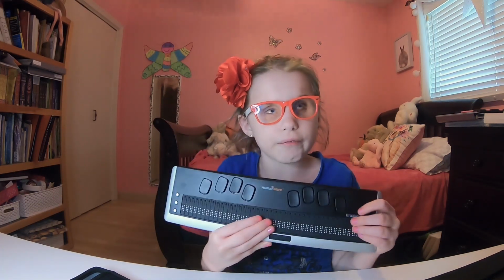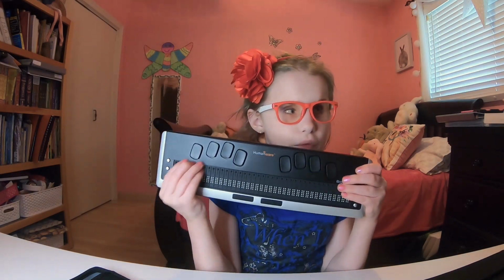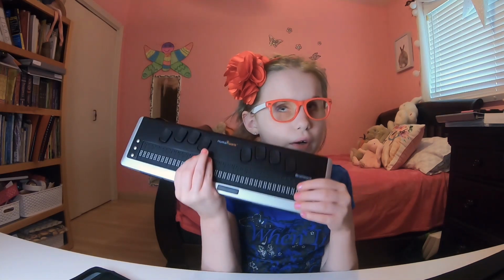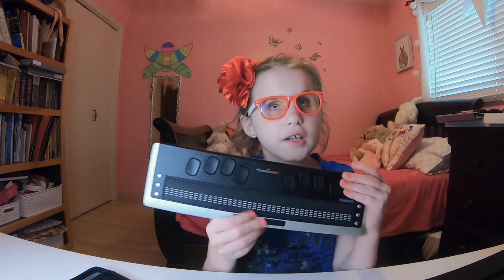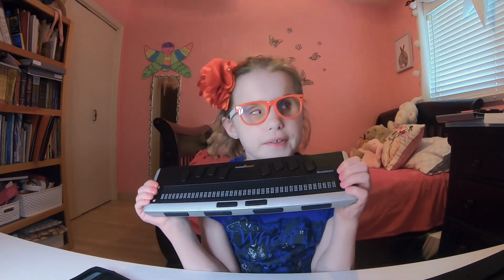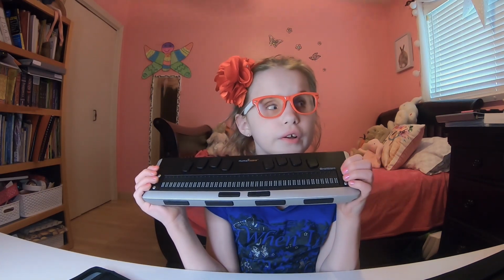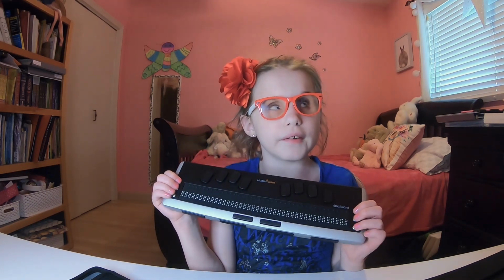Now, it's your 40 cell braille display. You have a 32 cell, 40 cell, and 80 cell braille display. But I have the 40, and you have your typical 4, 5, 6, 1, 2, 3, 4, 5, 6, 7, 8 keyboard, just like on the BrailleNote Touch. But one thing I want to point out to you is the 1, 2, 3, 4, 5, 6 command buttons. So there's 6 little circle buttons on each side, 3 on one side, 3 on the other. So those are really cool. You can issue commands. So for example, there's a lot of cool commands.